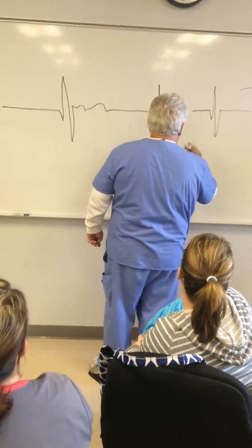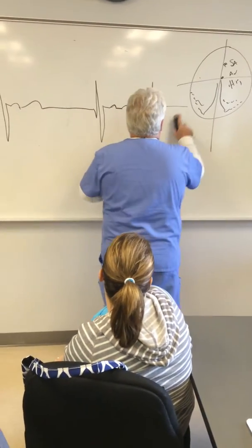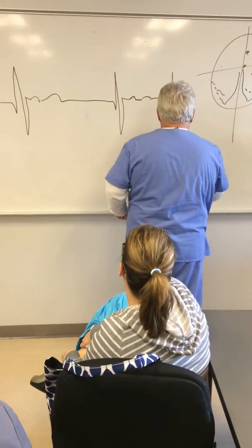So this is regular, rate 40 to 60. Brady, brady. This is the backward firing.